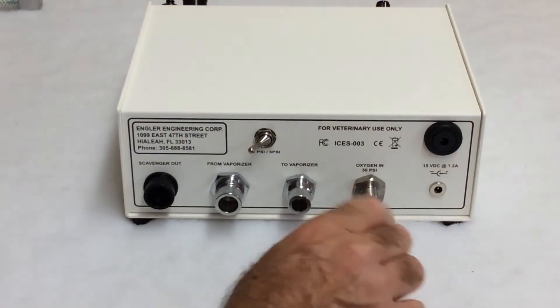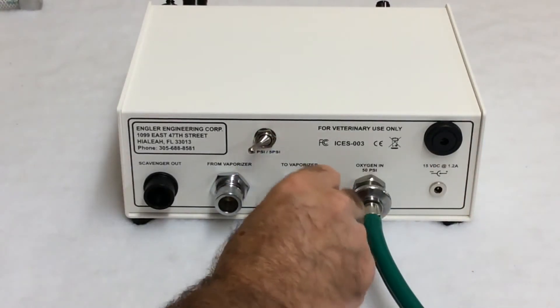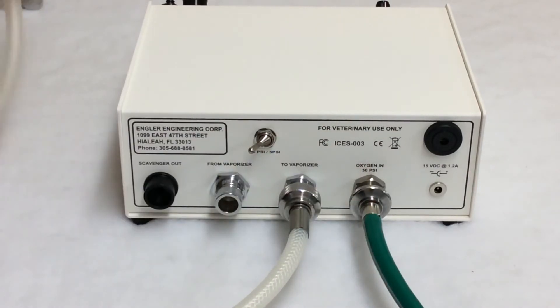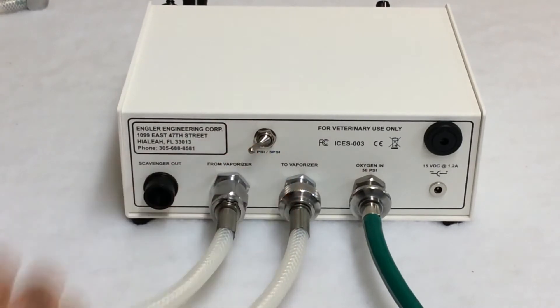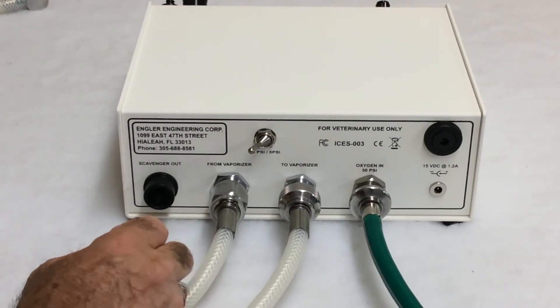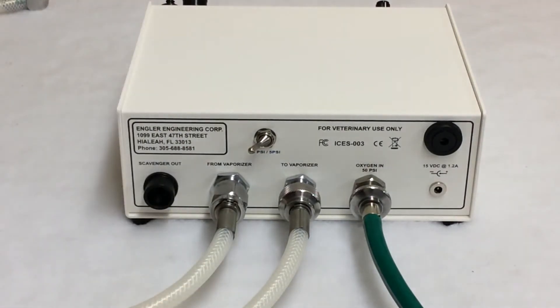This is how you connect the back of the ADS-2000. Oxygen goes here. To the vaporizer goes here. From the vaporizer goes here. If you'll notice, each port is a different size — you'll never have to worry about confusing these connections. Here we have the scavenger out port. For this example, I have an F-Air canister, which I will connect later.